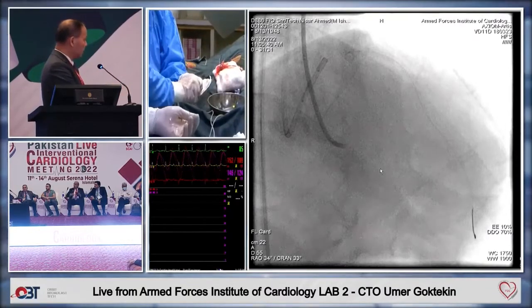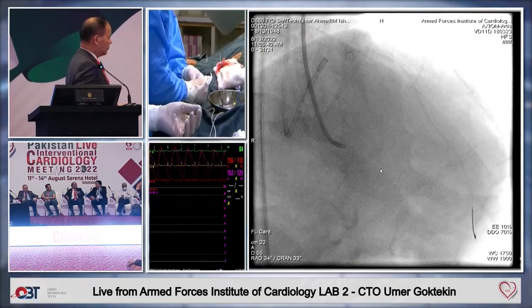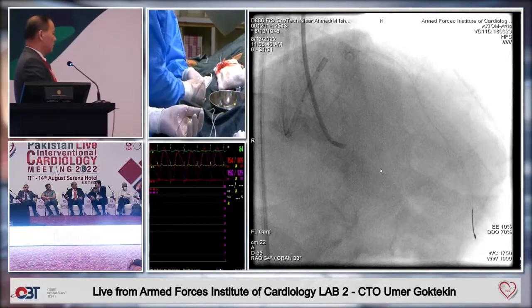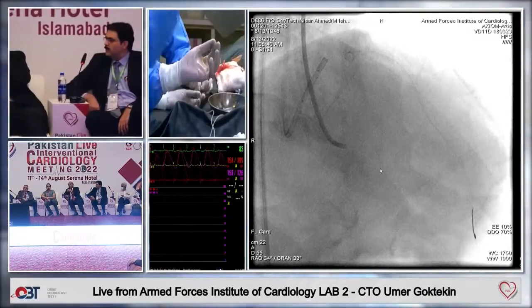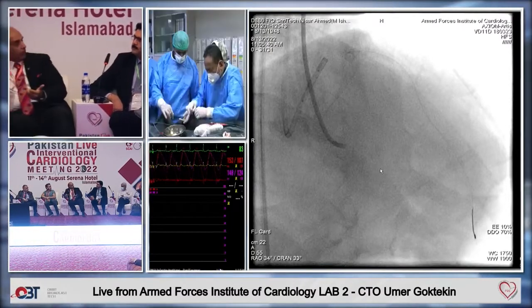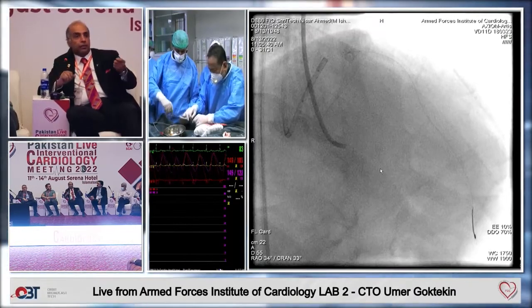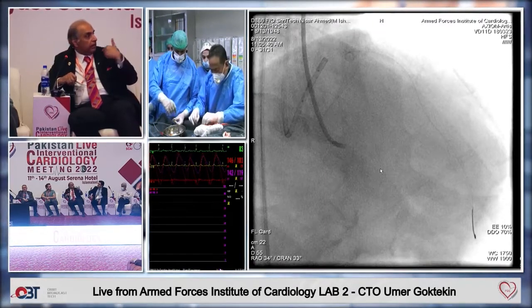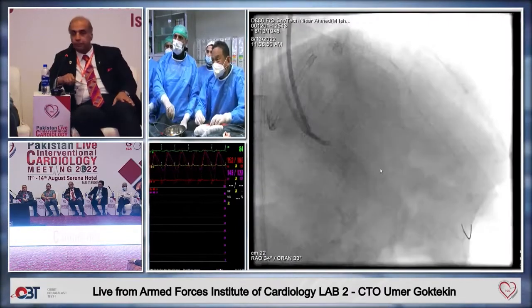2.5 by 15, compliant, semi-compliant. So how to take the microcatheter once it's out and you are taking it again in the vessel? With the trapping balloon, it's not possible to take it. The wire will go in and create problems. Normally, if you have to take it again, I normally put a wire extender on behind it. And once you have the wire extension, you are good. Or the other way is that if you don't have a problem, then you take a long length wire, place that in, and then take your microcatheter in. That way you're more comfortable, you're in a more controlled environment.